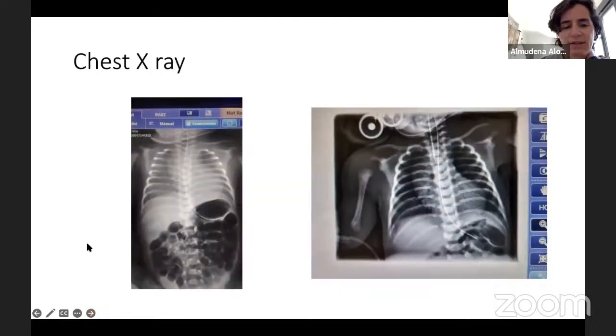Thank you. And this is finally just the X-ray. This is the first chest X-ray just before intubation. After being intubated and given surfactant and increased ventilatory pressure, there was a significant improvement radiologically on the X-ray, although it was not reflected immediately on the ultrasound. The timeline between these two X-rays is about 3 hours, on the same day, the day of birth.